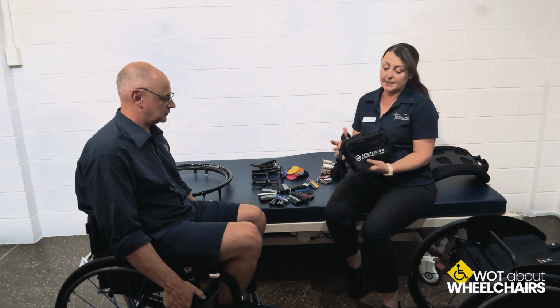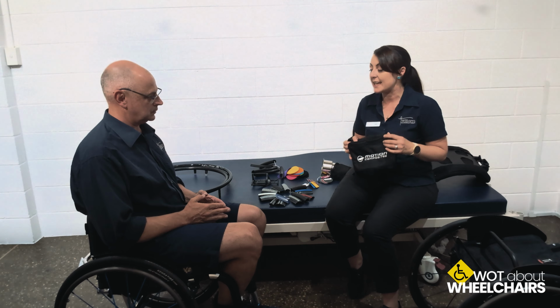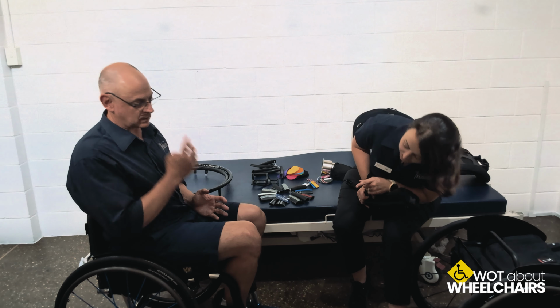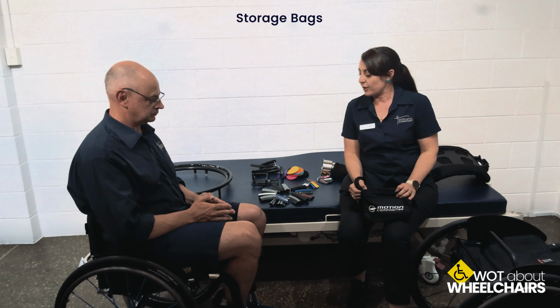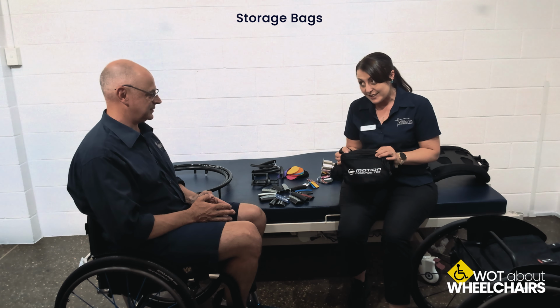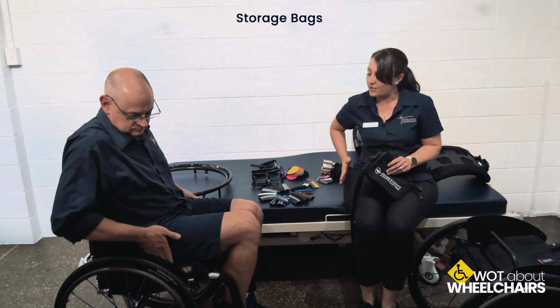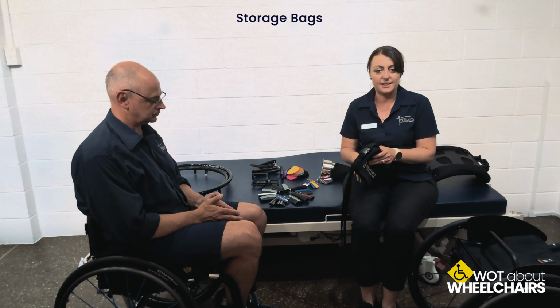Now, the next thing we're going to talk about is storage. One of the key things that I'm asked really frequently, and it's not on this particular chair, is where am I going to put my mobile phone? For a manual wheelchair user, that can be really difficult. And if you're sliding it down the side, they fall out, you lose it, you don't want that.